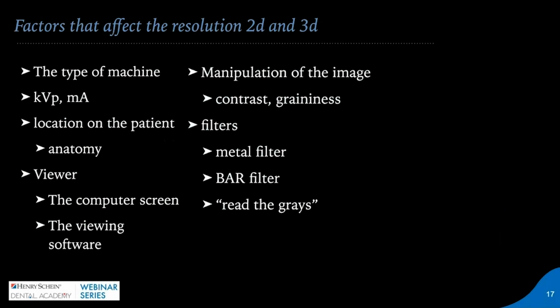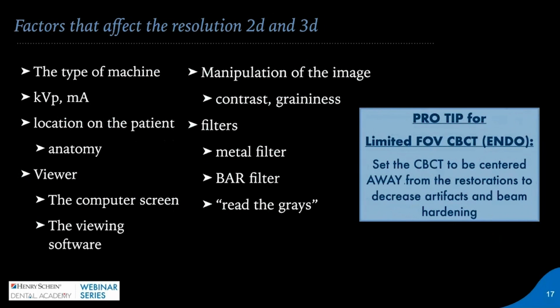But even down to the viewer, I have definitely seen major differences when using different software as well as a different computer screen. And you do have to manipulate the image as well to get the best view. It's just like any kind of photograph. You want to make sure you're checking different filters, like changing the contrast, making sure you're using smaller voxel sizes, that kind of thing.